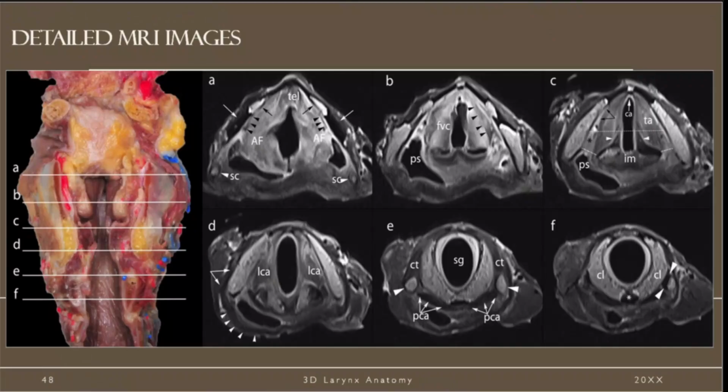The MRI can give us more detailed images, but it has a major drawback. It needs a lot of time. If the patient swallowed, spoke, or moved during the examination, you will have a very hazy image. You can't see any anatomy.